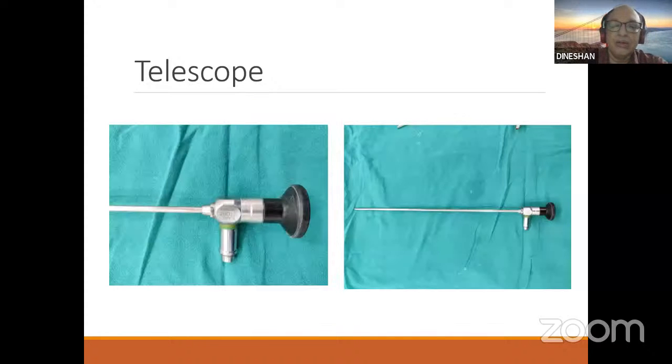Now the telescope has the rod lens system. Actually, in the original rod lens system, which started the transition, the rod shaft was acting as the lens.